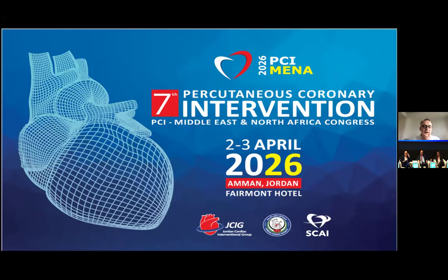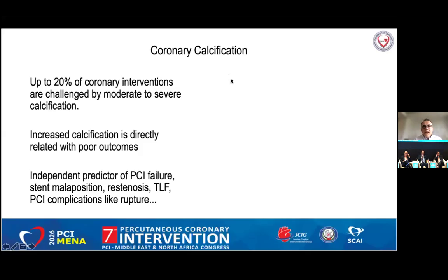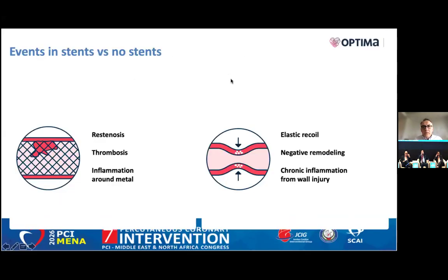Now in these DCB sessions, I have two talks. One is DCB in CTO lesions, and the other is DCB in bifurcation lesions. The first talk will be DCB in CTO cases, sorry, calcified lesions. So, coronary calcifications.